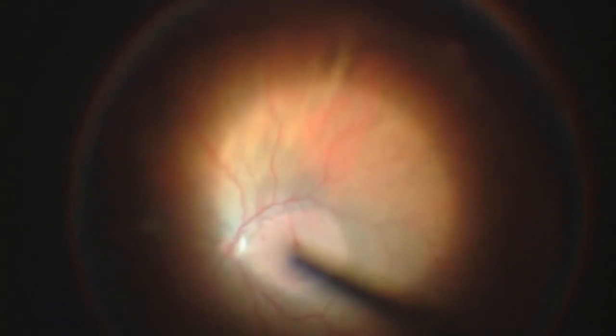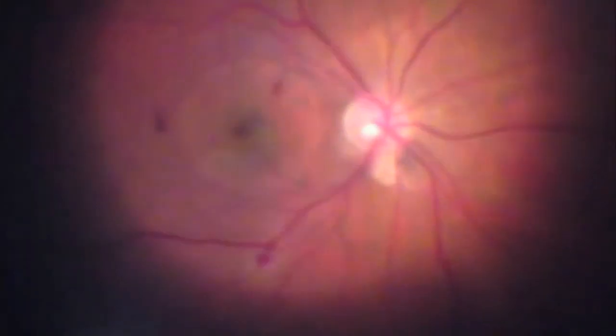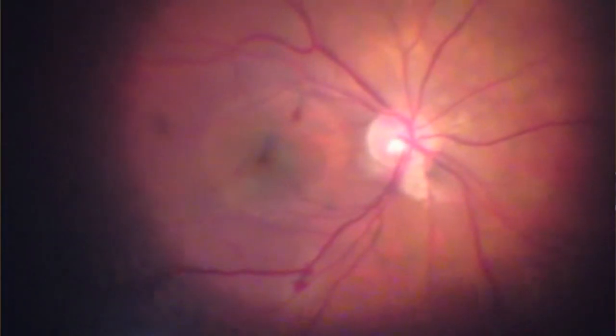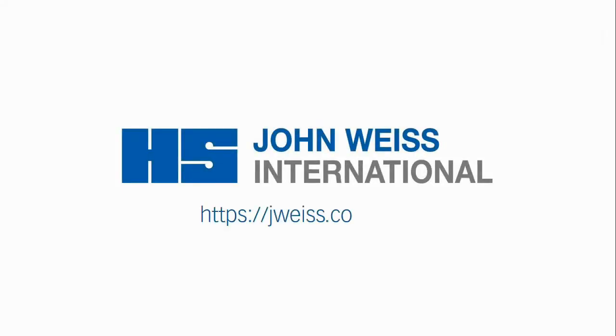During air-fluid exchange, the IBOS2 is especially user-friendly and provides best-in-class viewing. The system features optional sterilized disposable lenses with 90 and 124-degree viewing angles available.